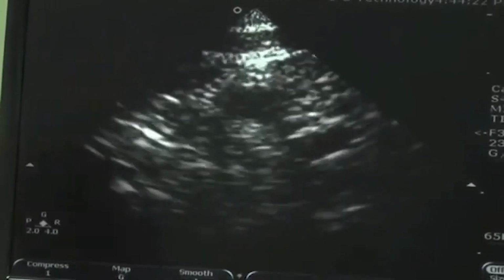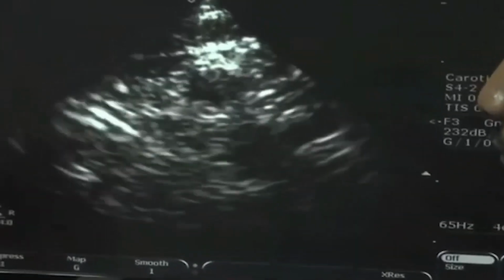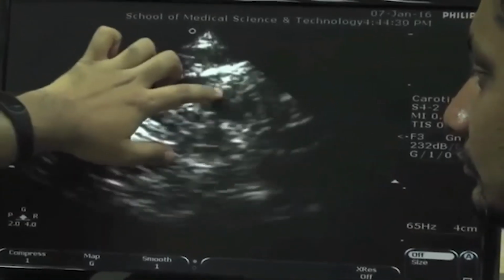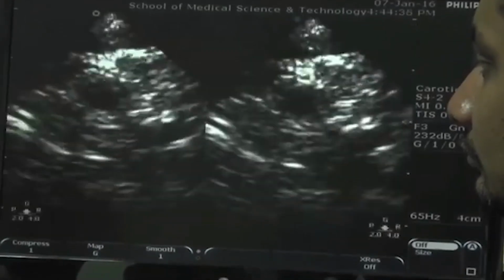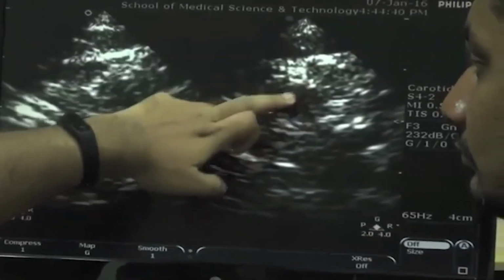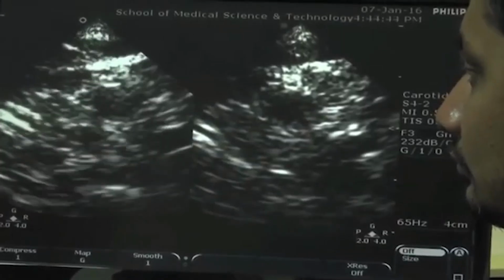Now interestingly, you see that the speckles are really large over here. It's in the order of a few tens of speckles that the whole carotid artery would be seen. Now let's actually freeze this one. I would put it on a dual monitor, so you can see this is one of those frozen views from this sectoral probe, and this side is my dynamic view.